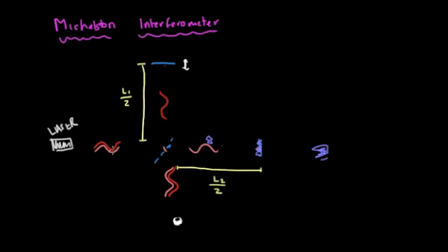problem is this pulse needs to be ultra fast. So remember, how fast does this pulse need to be? Well, light travels at 3 times 10 to the 8th meters per second. So if we open up this laser for a pulse for an entire second, then that's going to let 3 times 10 to the 8th meters of light escape.